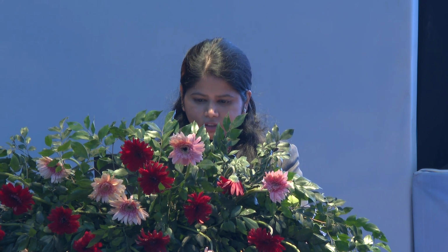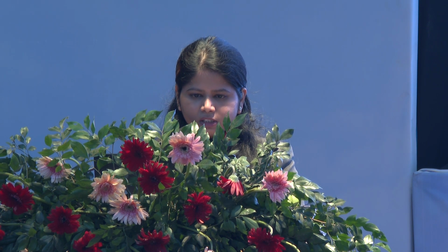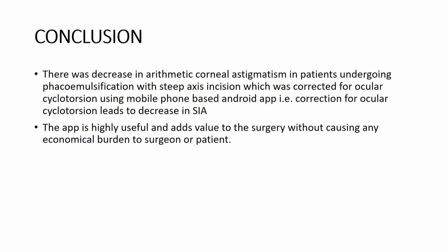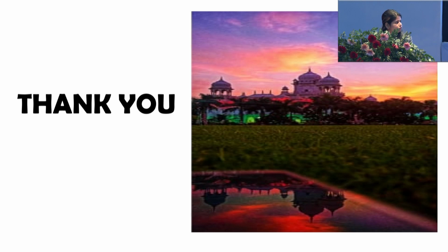clear corneal incision. Conclusion. There was a decrease in the arithmetic corneal astigmatism in patients undergoing phacoemulsification with steep axis incision, which was corrected for ocular cyclotorsion using a mobile phone based Android app. The app is highly useful and adds to the value of surgery without causing any economic burden to the surgeon or patient. Thank you.